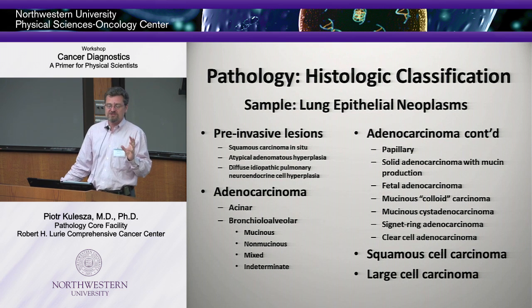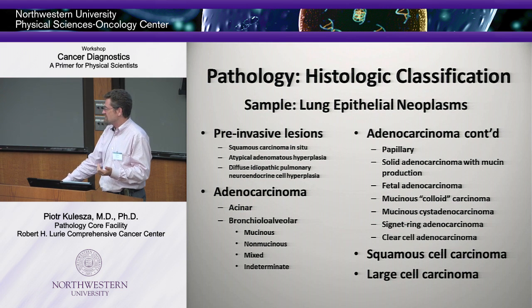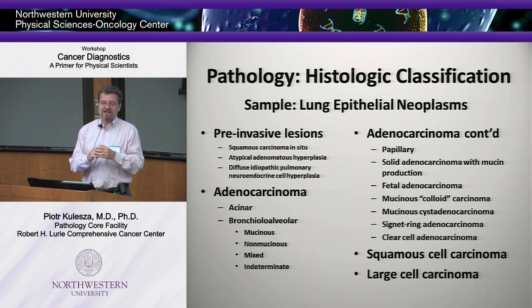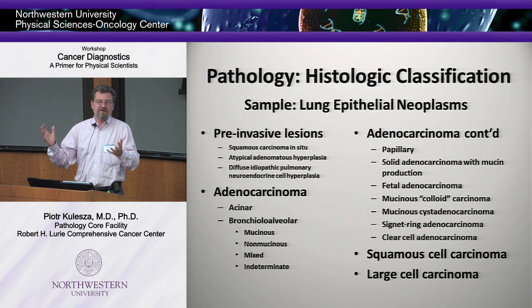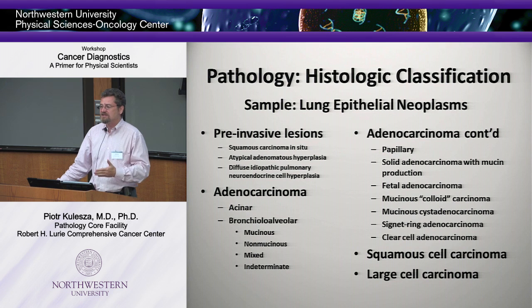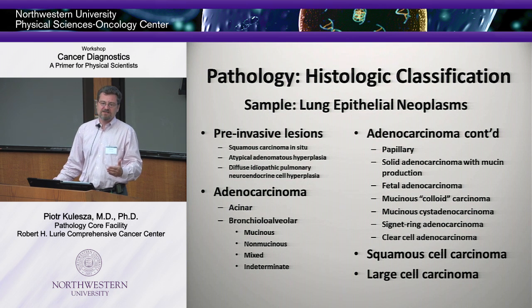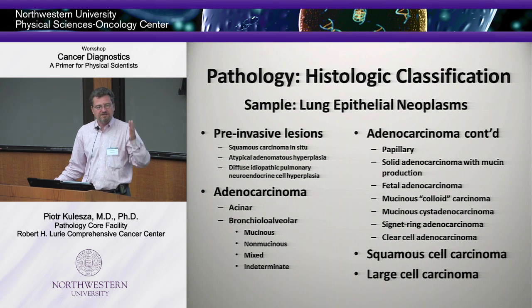These are very old terms that pathologists who are looking at this, and sort of like the CT developers in the 80s, this was Metchnikoff in the 1800s, saying like, what does it look like? Well, some of it looks like a signet, some of it looks papillary, it has papillae. So we've coined all these terms, and now, over the 100 years, we still use them because they're very descriptive, they're very robust, and they allow us to then subclassify these lesions and look at the outcome of the patient, okay? And they are consistent throughout time.